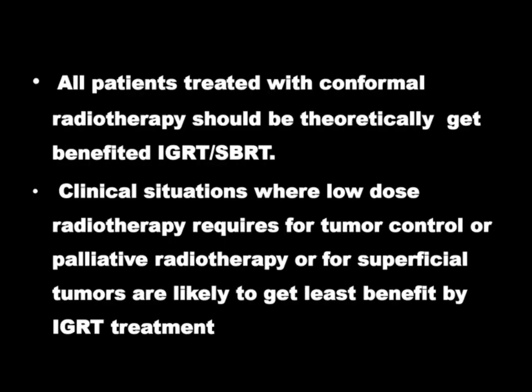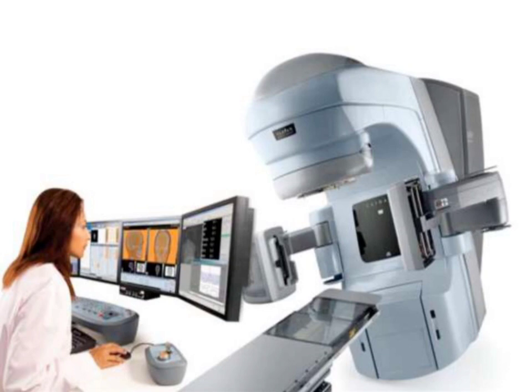Tumor may be concave, somewhere thick, somewhere thin. So the radiation dose to the thin area needs to be controlled, and the dose in the thick area needs to be accelerated and a little higher as per the plan of radiotherapy at an isocenter, so that adequate coverage is given and the organ behind the thin area receives a lower dose in order to protect the critical organs.